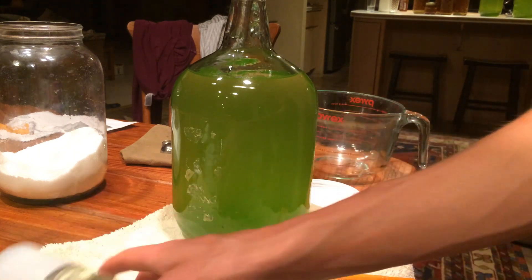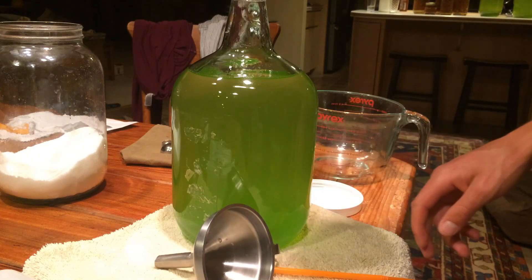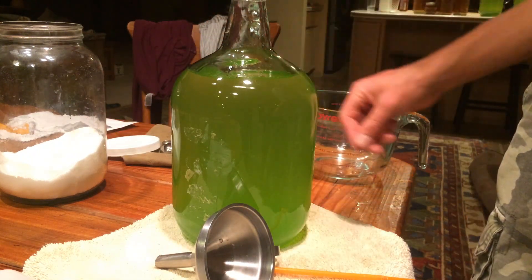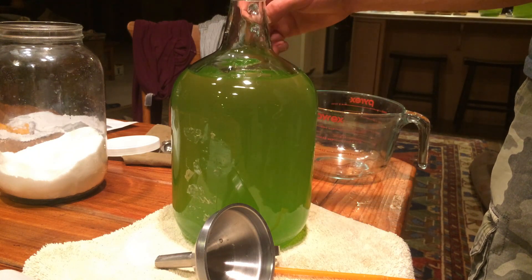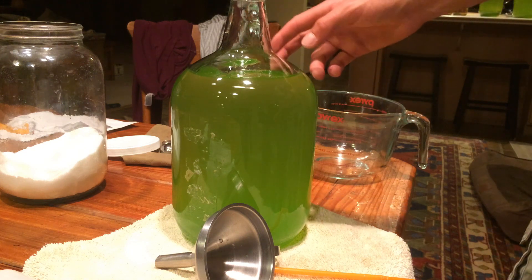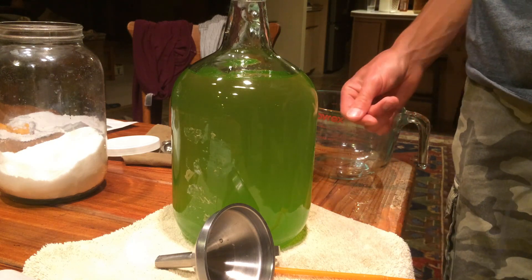That is how you culture algae. Make sure everything is sterile - I sterilized everything. You can sterilize with vinegar or rubbing alcohol beforehand, and just rinse it out afterwards. I am not using distilled water - we'll see how that goes. Some people use distilled water, some just use tap water. Our water is filtered but not reverse osmosis, so it does have some minerals in it. The next step is to hook it up to a bubbler, which I will show in the next clip.